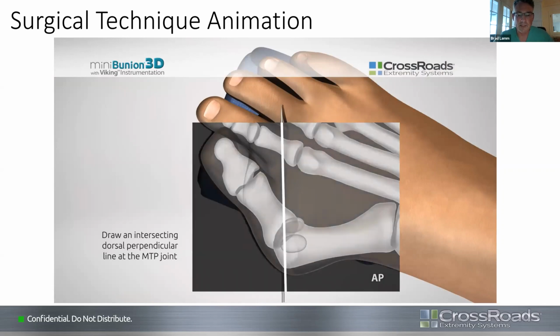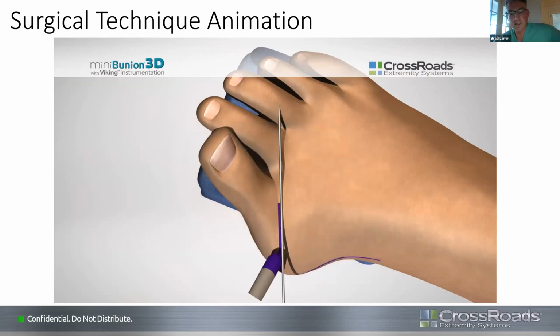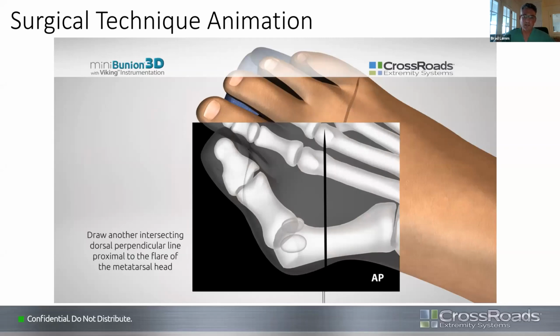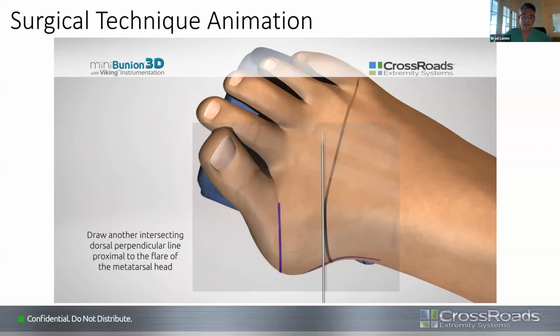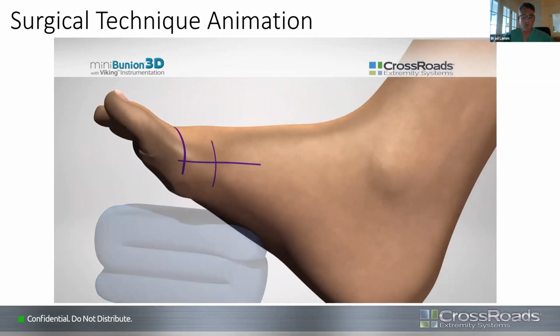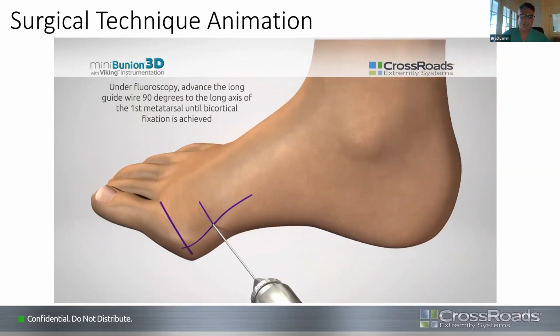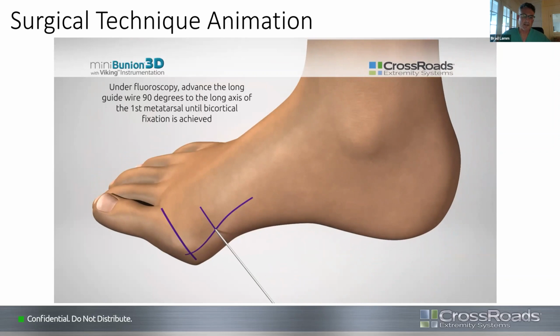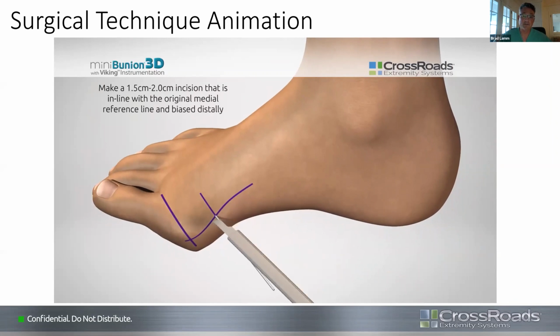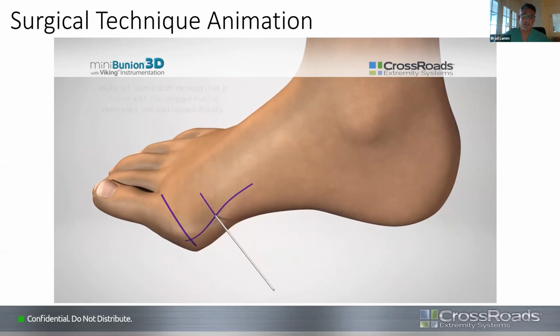Then you want to draw the joint line so you know where your joint is located. And then the second dorsal line will be at the neck of the first metatarsal. Just a bit proximal is where we're making our osteotomy, proximal to the neck. You insert a wire at the level of your desired osteotomy. This is done under fluoroscopy guidance, 90 degrees to the first metatarsal shaft. So you want to look at the AP, and you make it 90 degrees to the shaft.